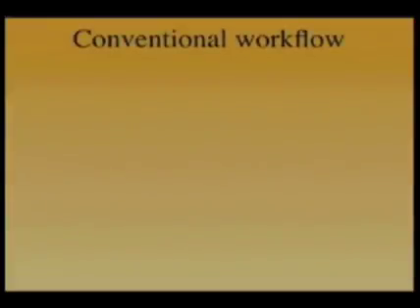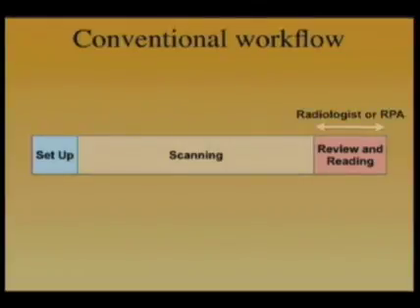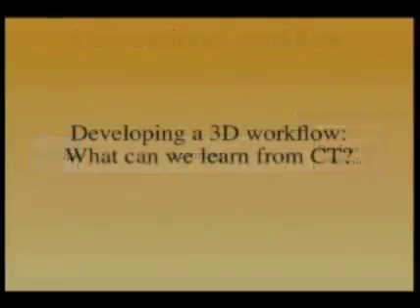Well, in order to understand that, I think we need to talk a little bit about workflow in ultrasound. In conventional workflow, the patient is brought into the ultrasound scanning room, set up on the examining table, the machine is set up with demographics and so on, and then there's some period that's spent scanning. Finally, the scans that are obtained, whether they're ultrasound clips or static images, are brought to a radiologist, or, as we've used at UAB, a radiologist physician's assistant for review and reading.